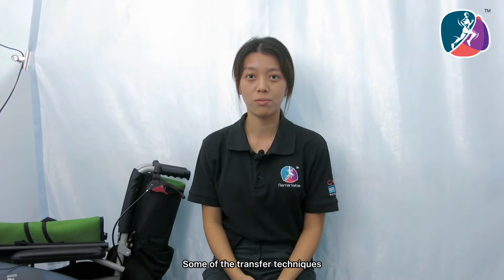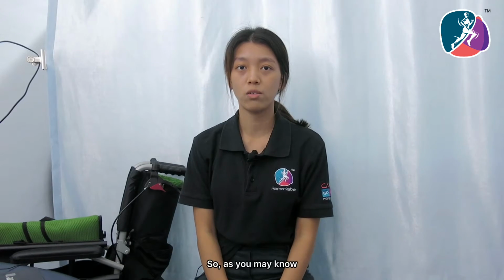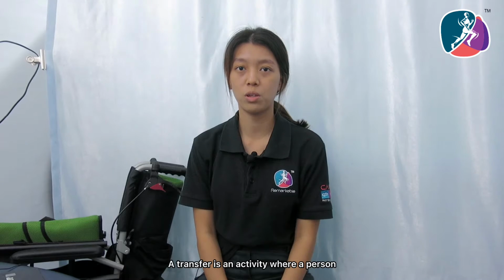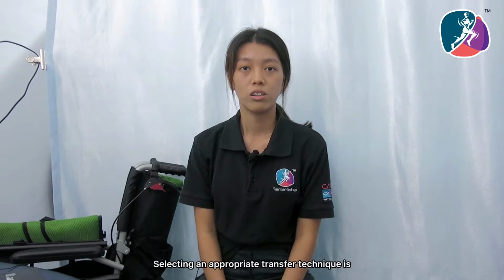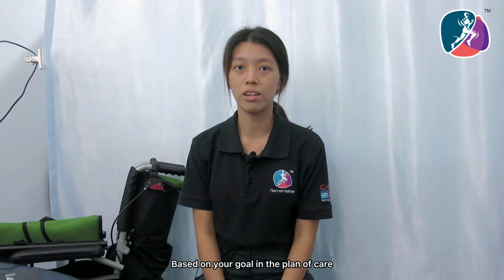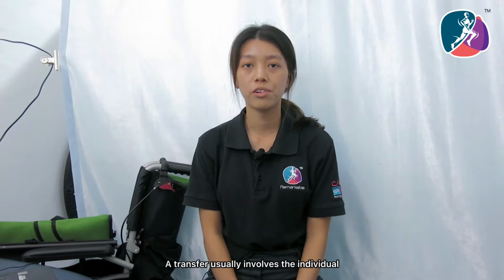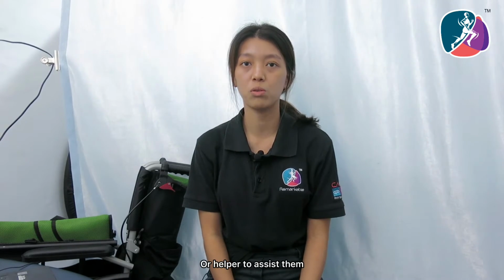In today's video, we will be demonstrating some of the transfer techniques that you can follow along and learn to do at home. So, as you may know, a transfer is an activity where a person moves from one surface or one position to another. Selecting an appropriate transfer technique is based on your goal in the plan of care. A transfer usually involves the individual themselves or with another person or helper to assist them.